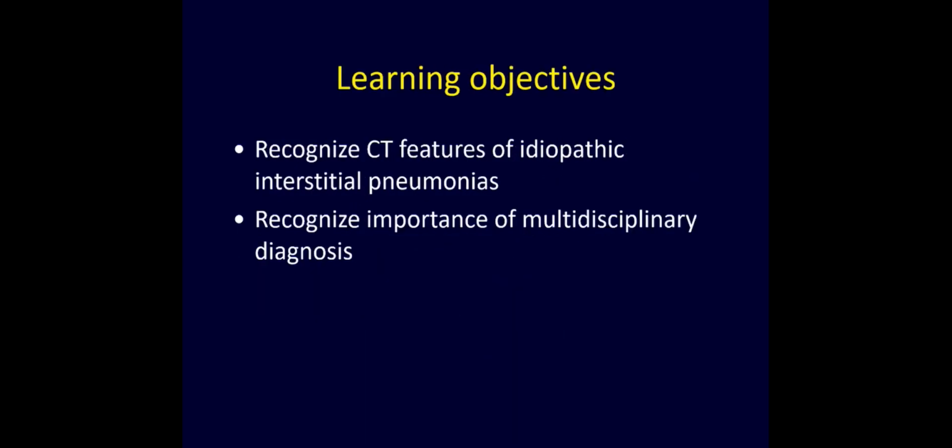The learning objectives for this talk are first to help you to recognize the CT features of all of the idiopathic interstitial pneumonias with a focus on the more common entities, and finally to recognize the importance of multidisciplinary diagnosis in establishment of a diagnosis of IIP.